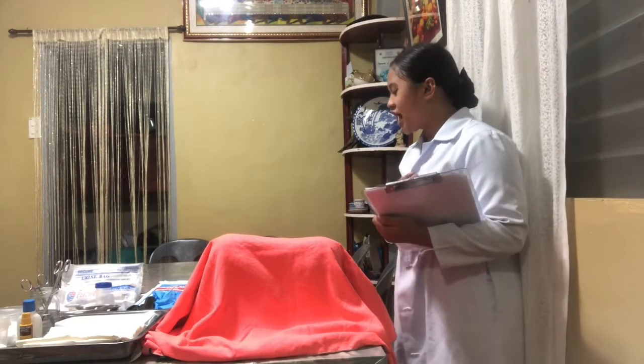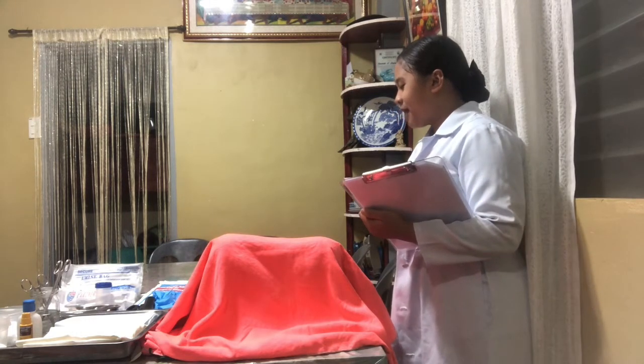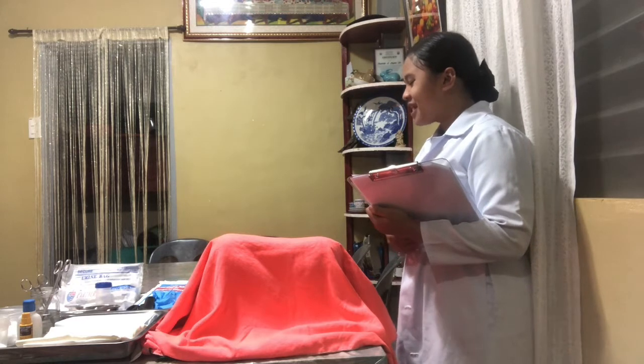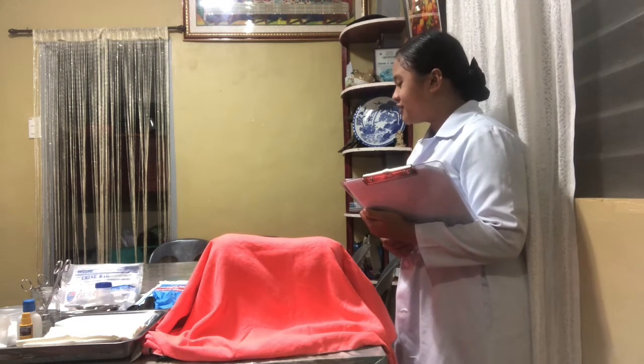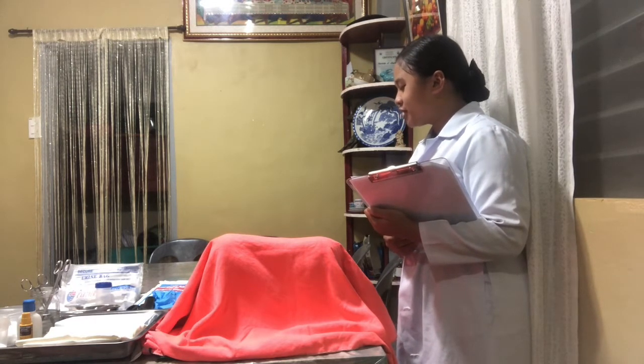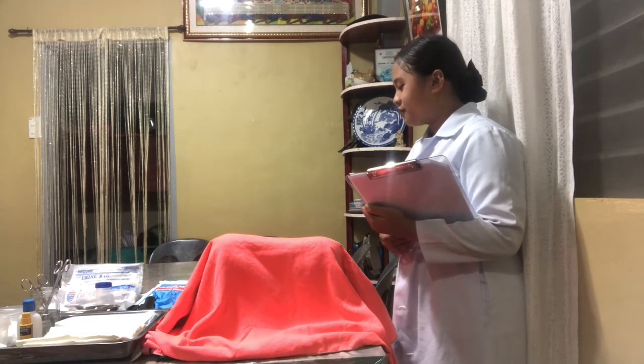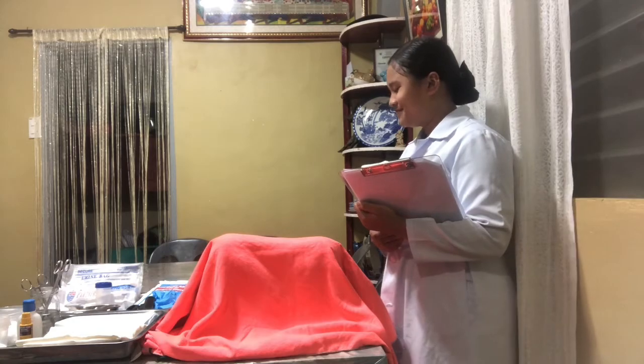Good morning, sir. I am Nurse Cristel. May I know your name? Bob? So, sir, I'll be doing the urinary catheterization. I just want you later, Bob, to take a deep breath and be comfortable while I am doing the procedure.